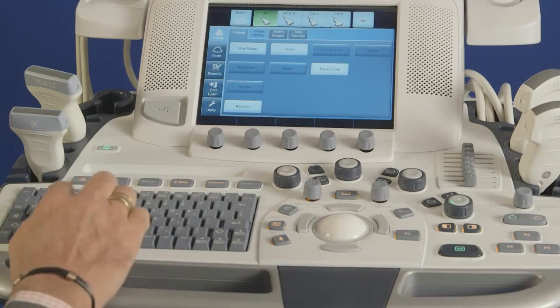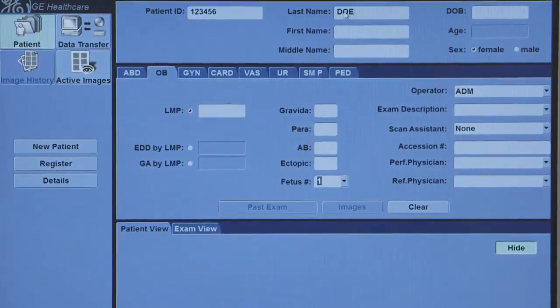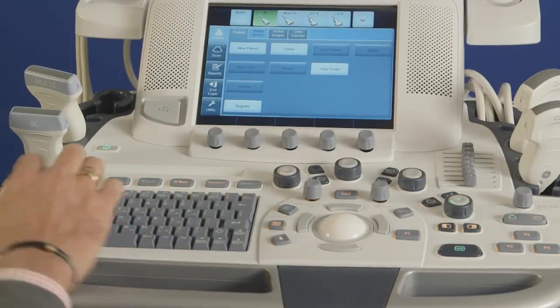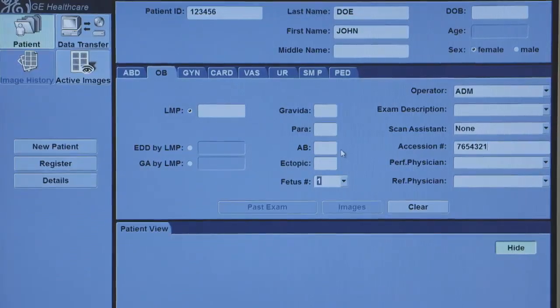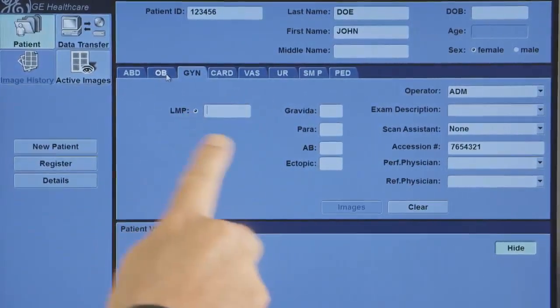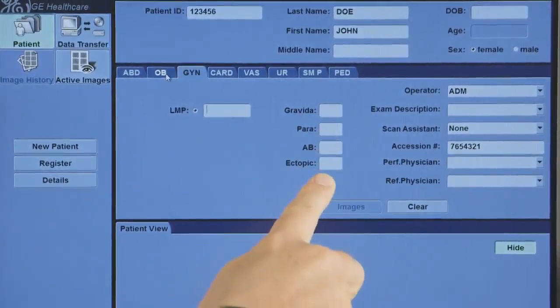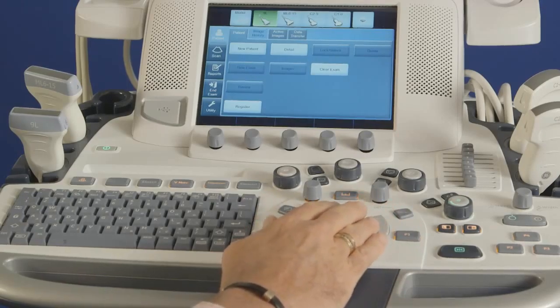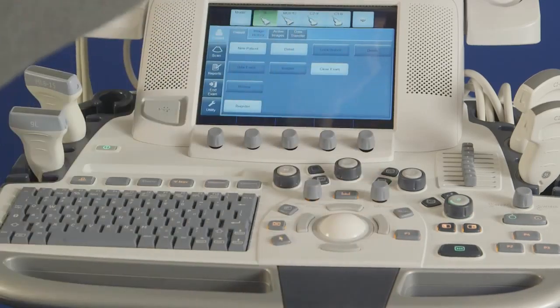The Logic system has multiple ergonomic features that can be adjusted for optimal system operation and to enhance scanning comfort. On the Expert Series, to raise and lower the system, hold the double vertical key on the front handle for electronic movement of the console. To activate floating keyboard side to side, press and hold the lock release button just left of the vertical key. Hold down for float function and release to hold the console in place.